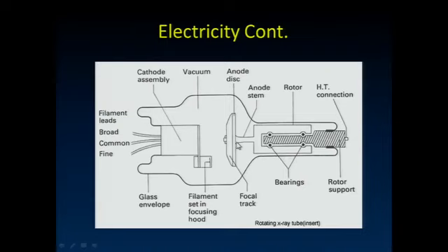And that's on the order of 100,000 volts. And that electron is now accelerated towards that anode and strikes it with a lot of energy. How much? Well, 100,000 electron volts, 100 keV when it strikes that. That's how much kinetic energy it has. That creates a lot of heat that ends up dissipated in this anode here. And so we really need to help dissipate that heat, and one thing we do is then rotate the anode.